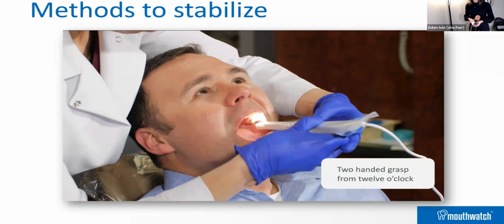This is also my favorite way to take images of the lateral border of the tongue. That's a tricky spot to take an image, and that's a lot of times where we see lesions. So what I like to do is I stand behind my patient, have my camera in a modified pen grasp, palm grasp here. I have my 2x2, grab my patient's tongue, pull it to the side, and then I come in and I have nice strength because I'm in a nice stable position. My arm is tucked in by my side. I can retract that cheek. I'm pulling the tongue to the side. I'm very stable, and I can get that image of the lateral border of the tongue, which could be a really tricky one to get.